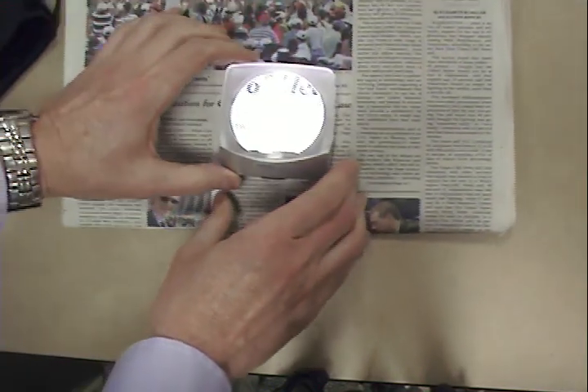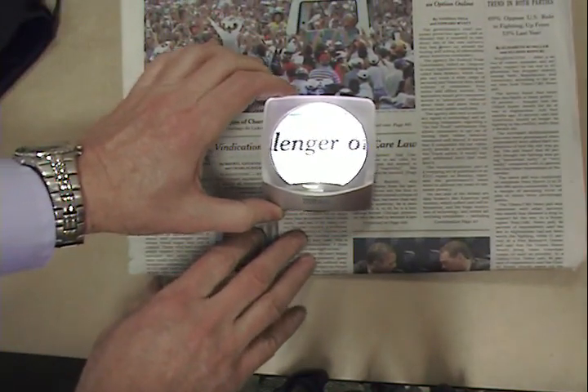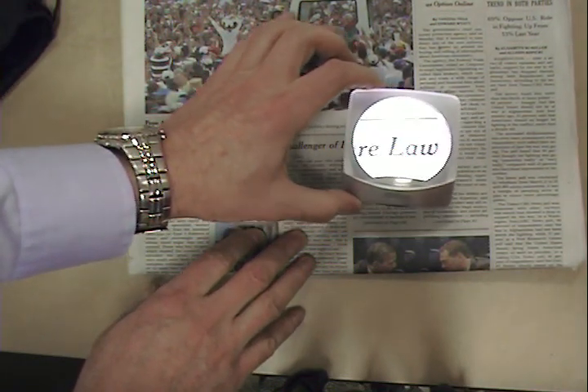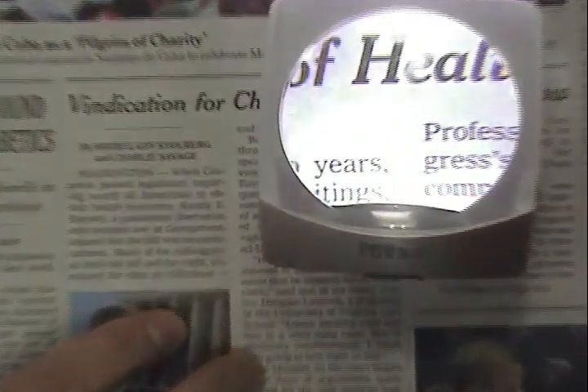The product uses a bright SMD LED that lasts 10,000 hours and is energy efficient, so that the AA battery lasts longer, making the Minus Lux very economical over the life of the product.